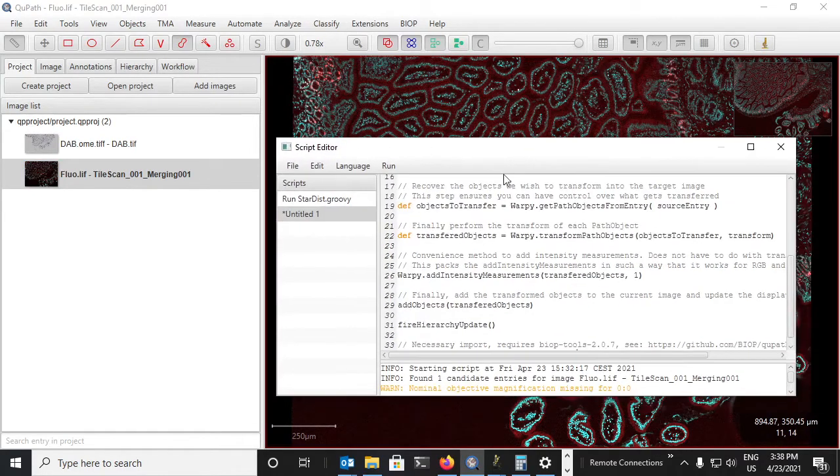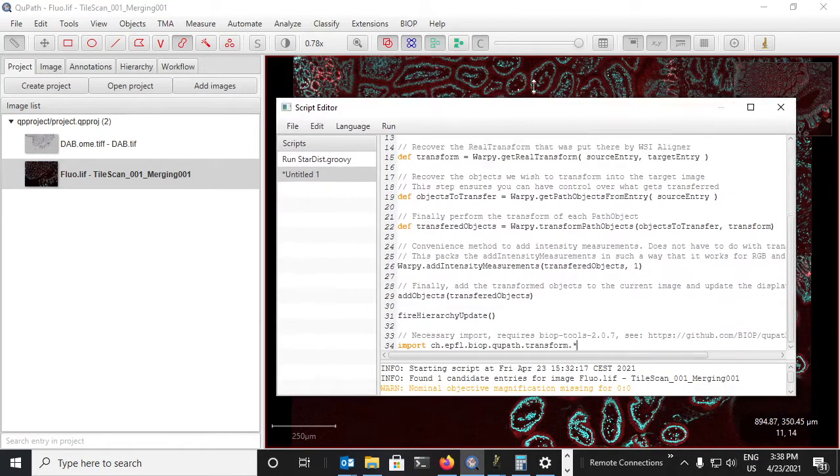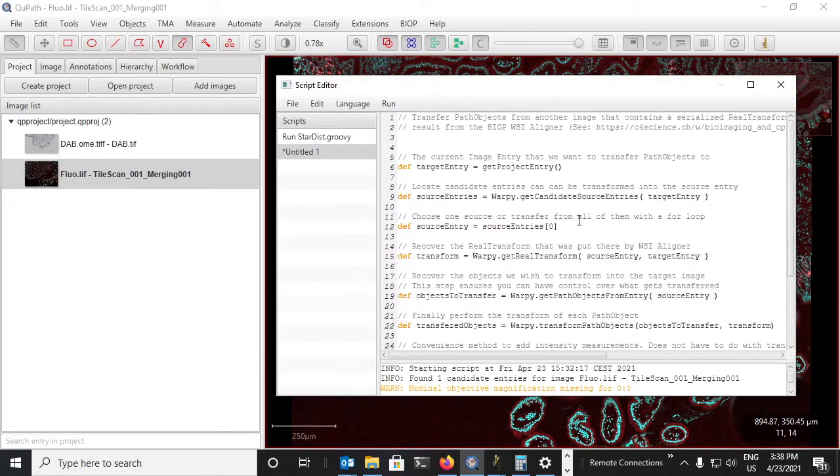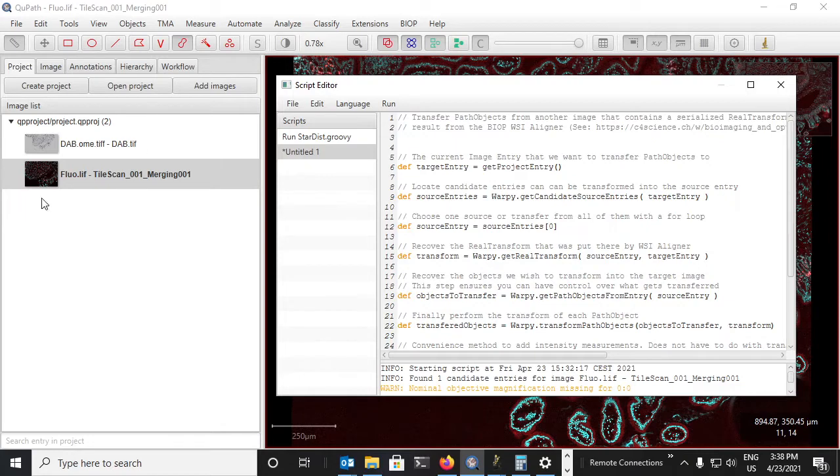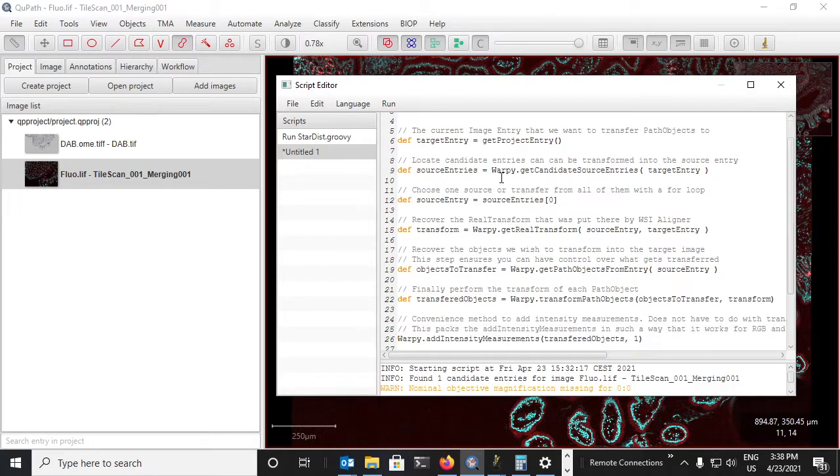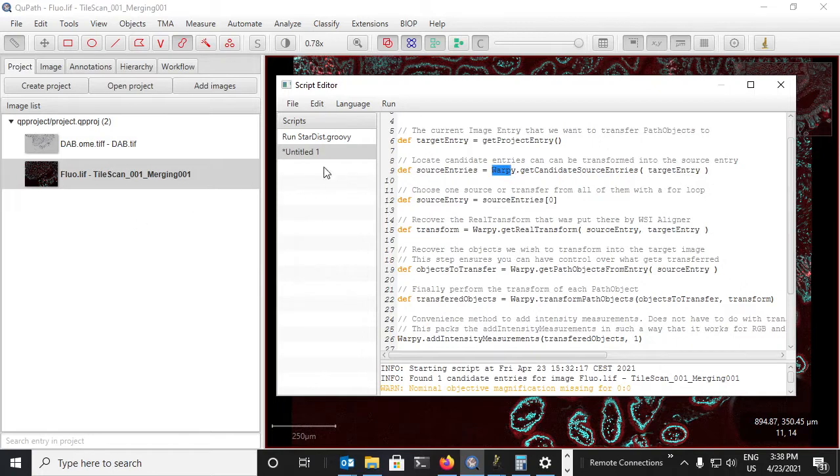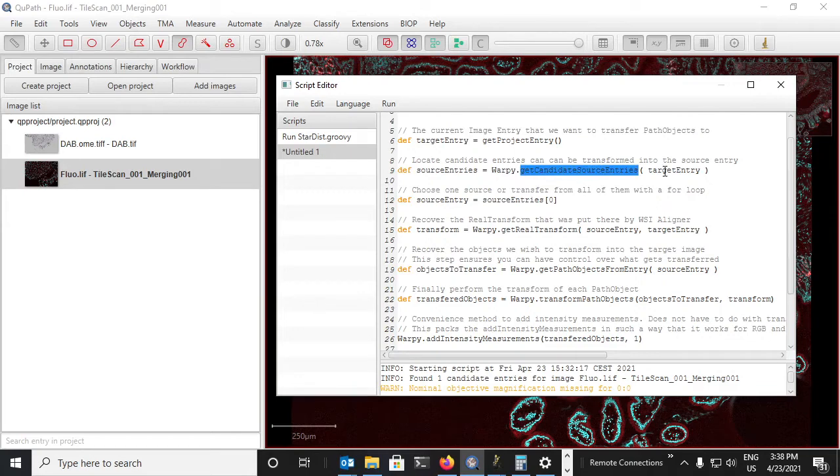So let's go through what this does a little bit. We take the currently open project entry, which is the image. We use this Warpy class, which is something we've written as an extension for QuPath that allows us to get any other images in the project.